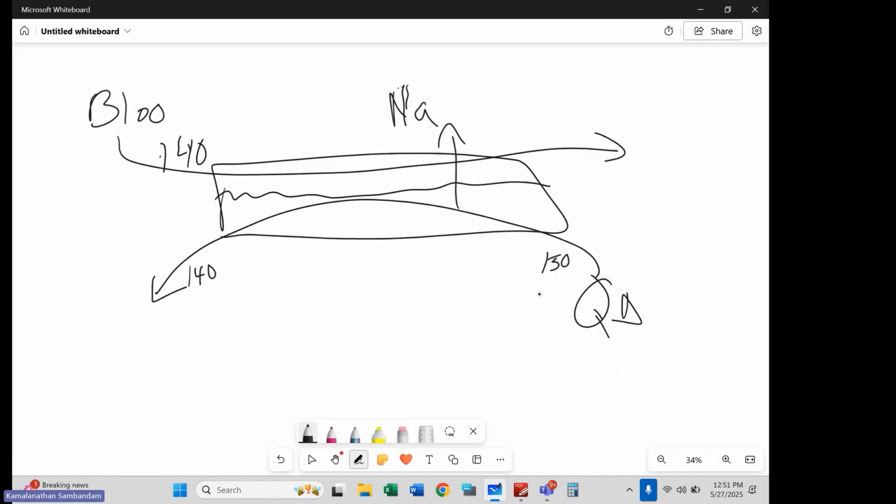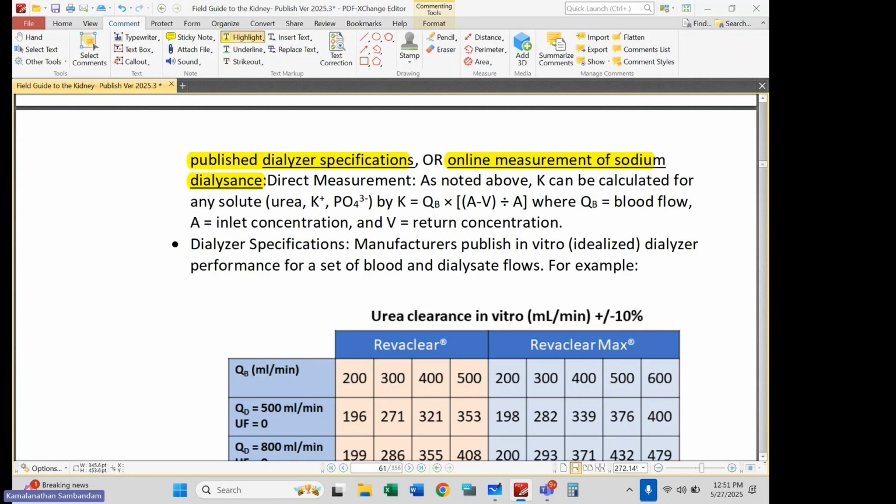And then it drops the sodium concentration to around 130 or so and measures the increase in sodium across the dialyzer. Okay? And so the flux of sodium from the patient to the dialysate is used once again to measure small molecule clearance. And the assumption is that urea should act like sodium, and it kicks out an estimate of urea clearance based on that change in conductivity of dialysate as determined by sodium concentrations in the dialysate.